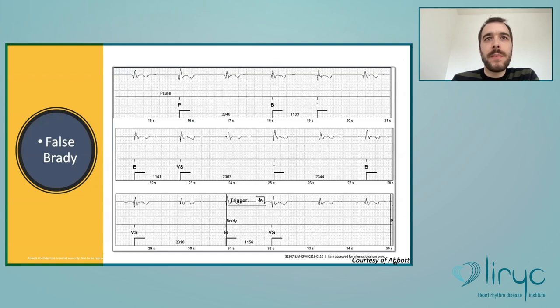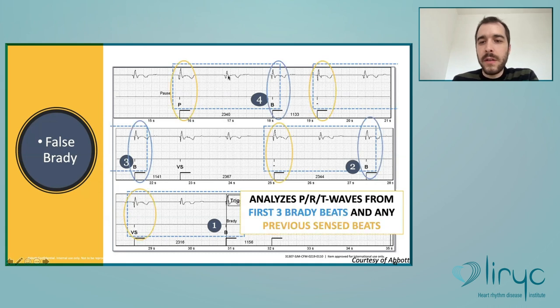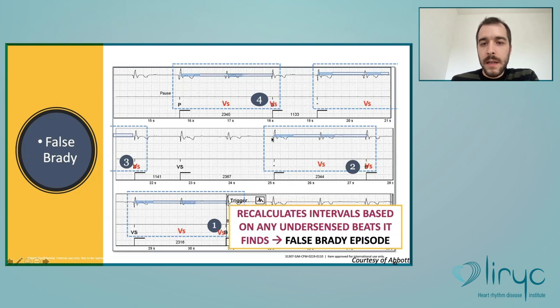And here is an example of a false Brady. So here you have the cycles that are labeled as Brady, but here you have cycles where there are no markers. So clearly undersense beats. So the device will calculate the secondary threshold and will be able to find these beats, which will reject the episode. And this can considerably decrease the false positives. So this, in fact, is working pretty well in this device. It's not perfect, but still.